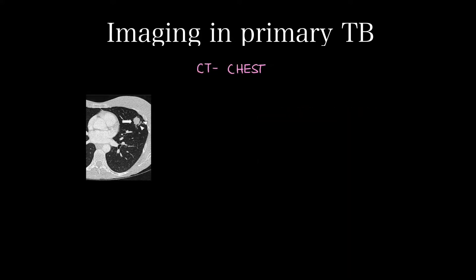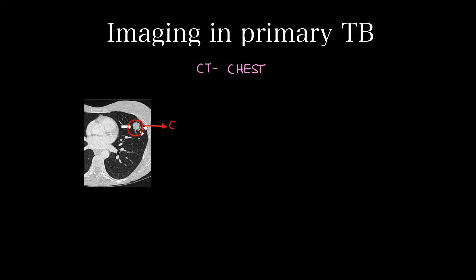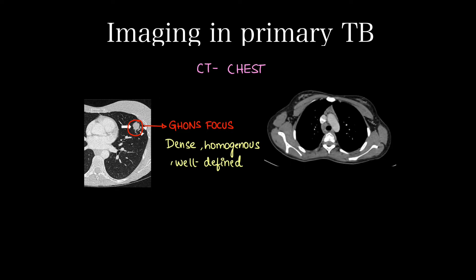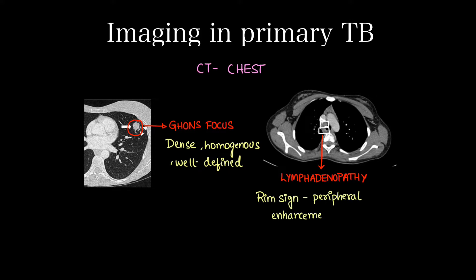On CT chest we can see the Ghon's focus as a dense, well-defined, peripheral homogenous nodule. The lymphadenopathy associated with Ghon's focus shows a rim sign — peripheral enhancement with central non-enhancing necrotic areas. It can also show heterogeneous enhancement.